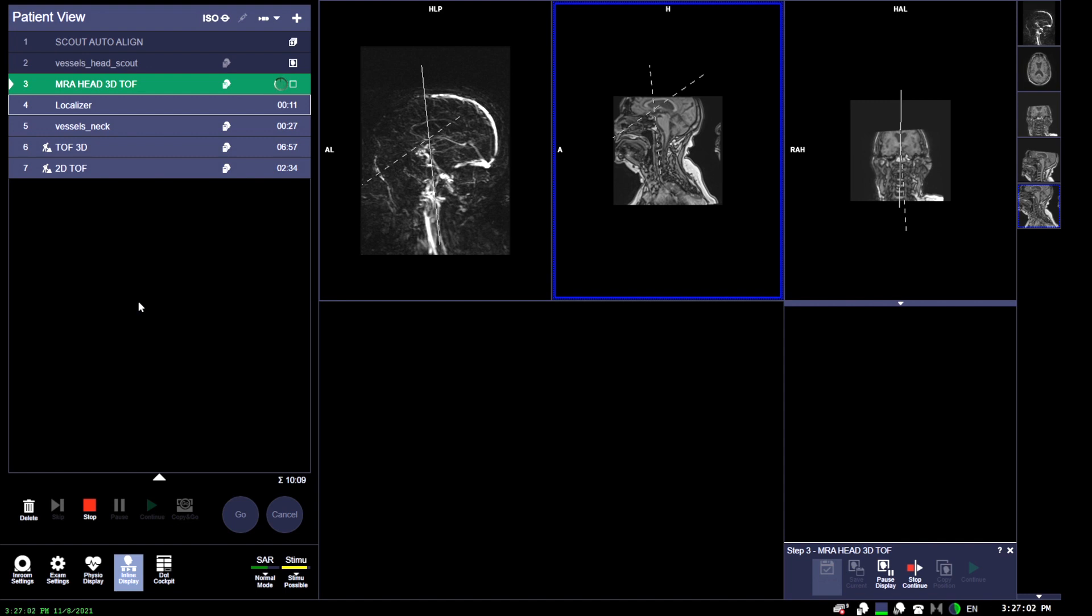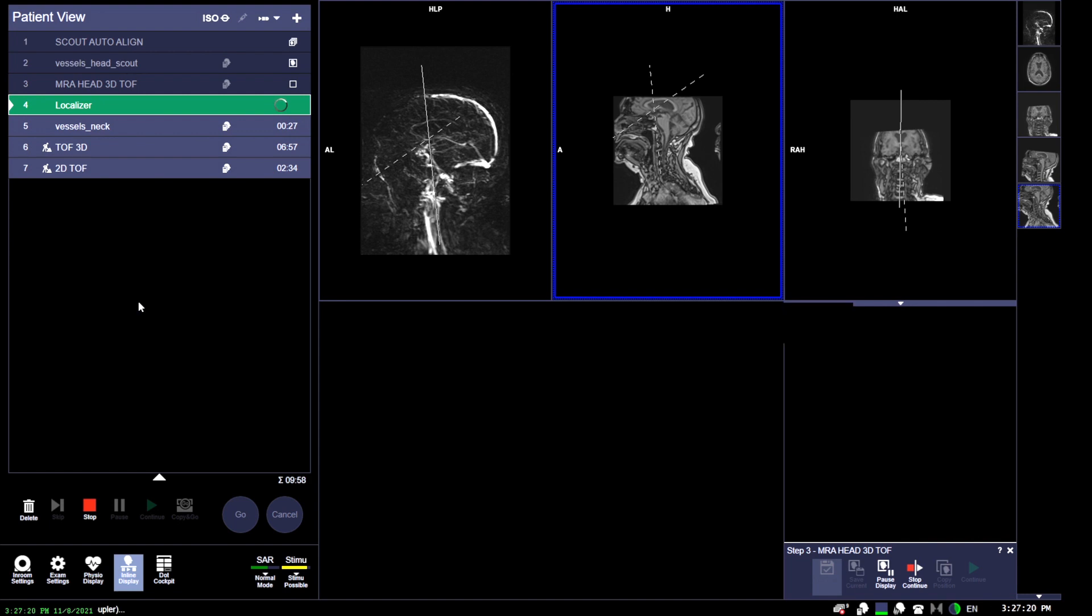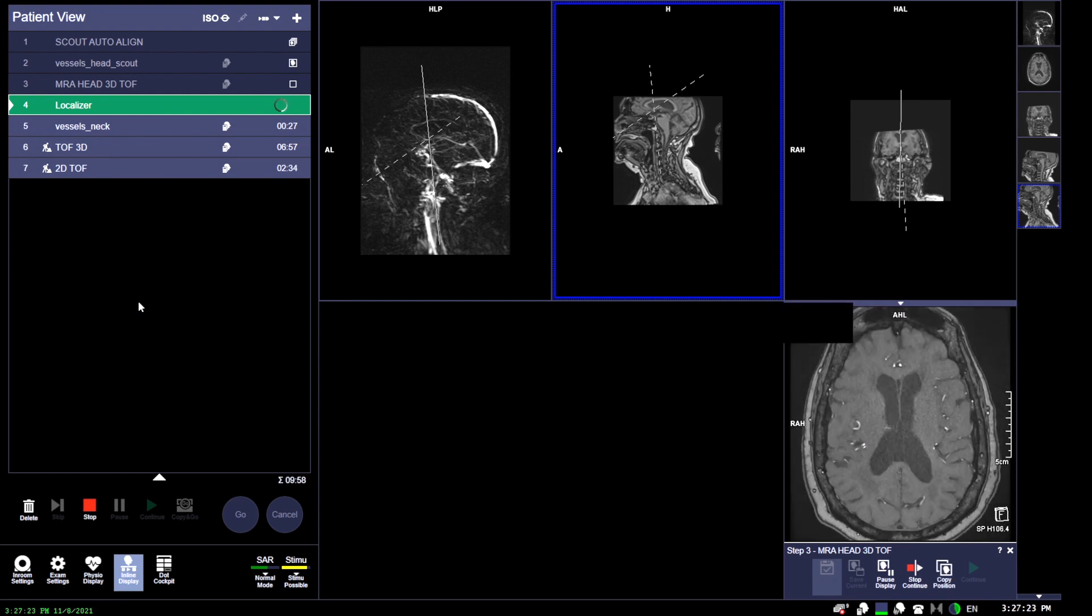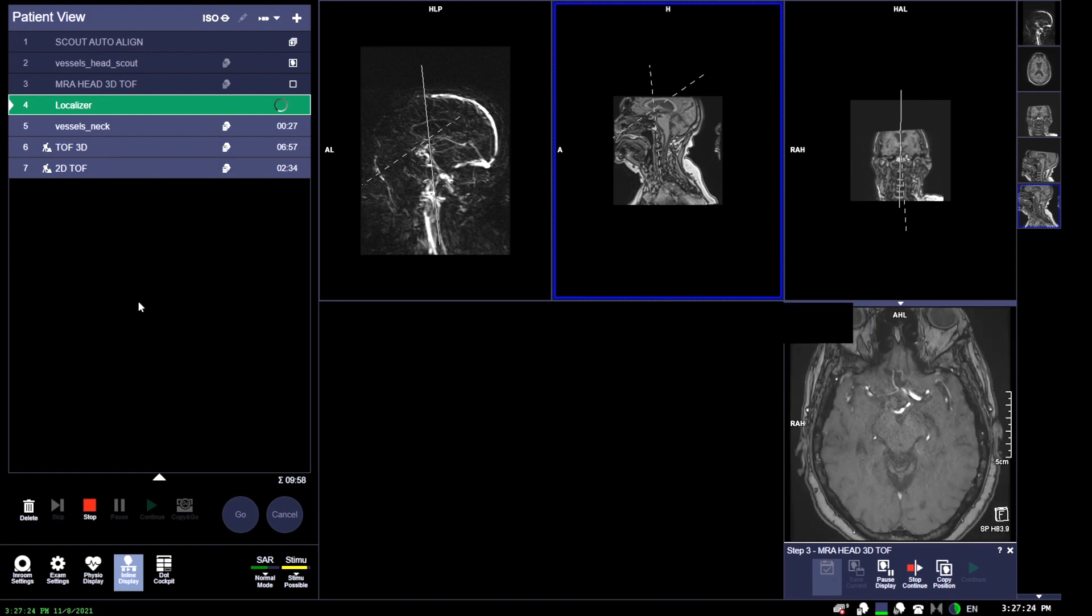As we conclude this scan here, we can see that you're going to be left with something called source imaging. This case does require post-processing, where you're able to do something called mipping, where you're going to be cutting any external unnecessary anatomy out so you can focus specifically on the circle of Willis.